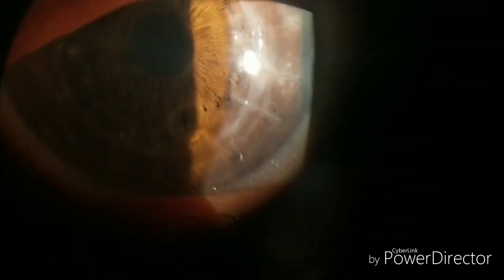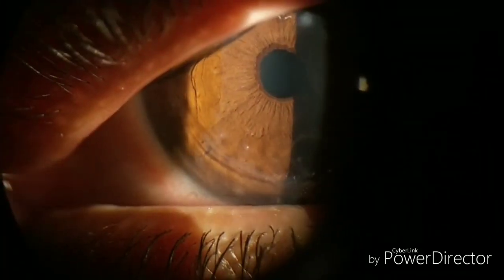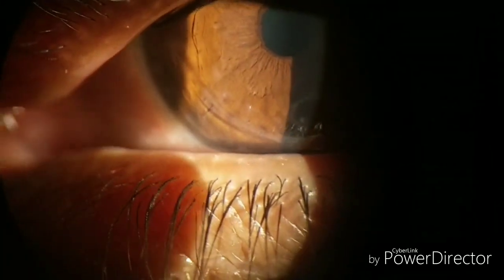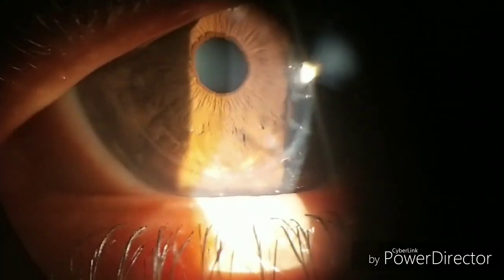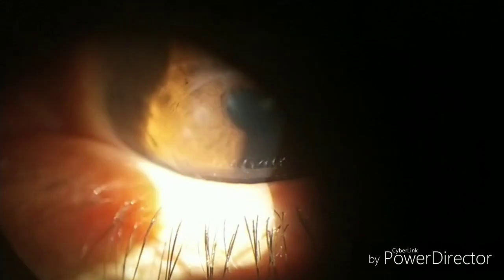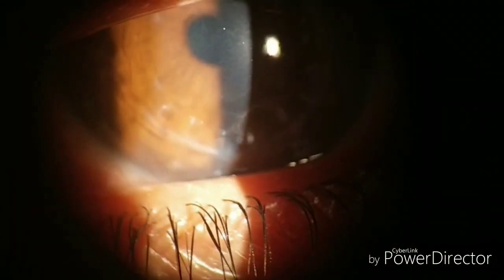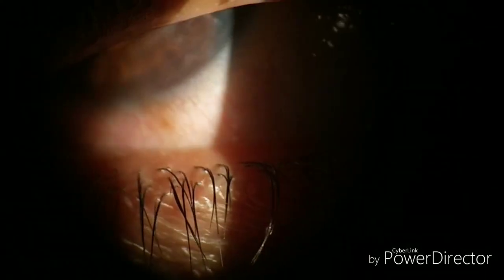Hi, I am Dr. Sharjeeal, and today I am showing you this 25-year-old male patient with bilateral full thickness penetrating keratoplasties. Corneal graft cases are a must in every ocular exam. Here I would like to discuss a few most common questions asked: when the procedure was done, whether full thickness or partial thickness — determined on slit lamp examination — and why it was performed, most importantly the cause.